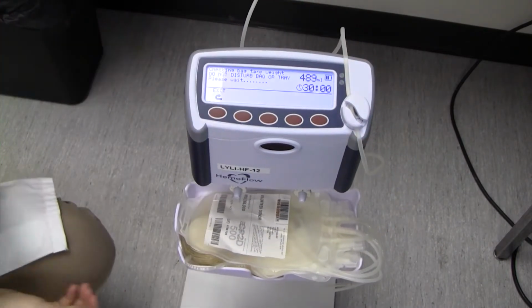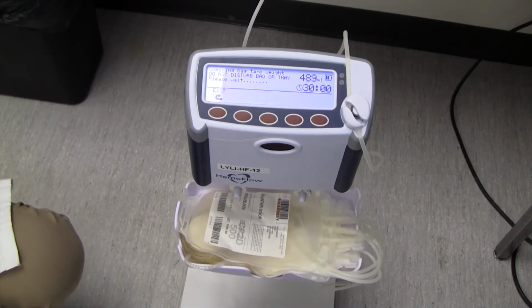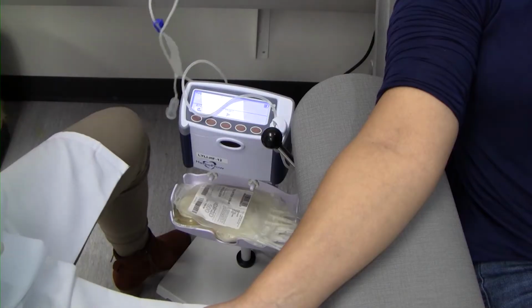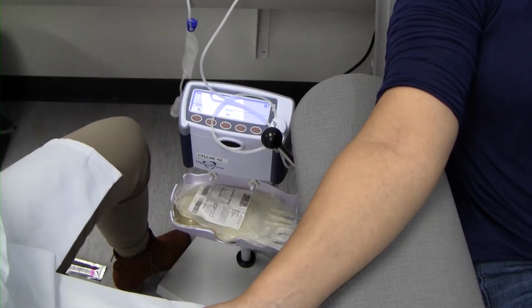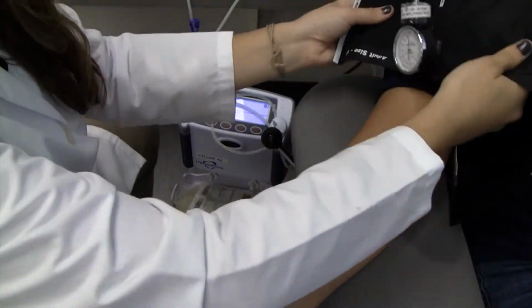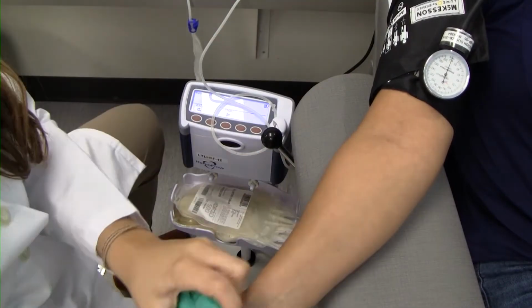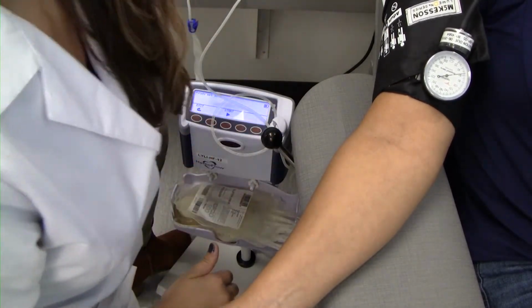Press Next. Follow the scale prompts and do not disturb the bag or tray while the scale determines the tare weight of the bag set. Clamp tubing with a hemostat between the phlebotomist protection device, PPD, and Y. Perform vein selection and arm preparation. Apply tourniquet or BP cuff to the donor's upper arm.